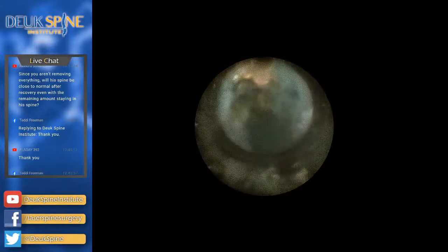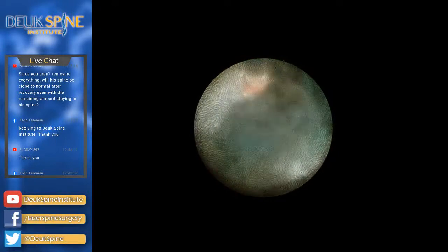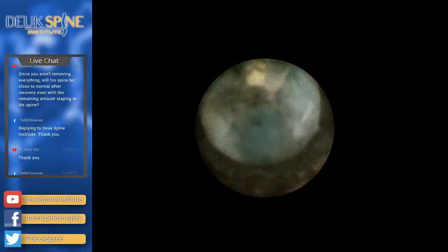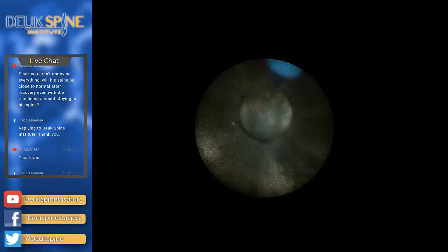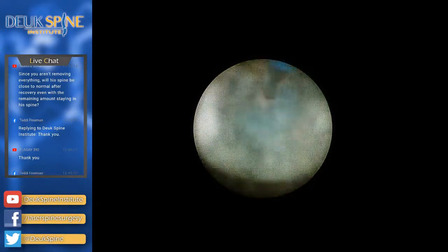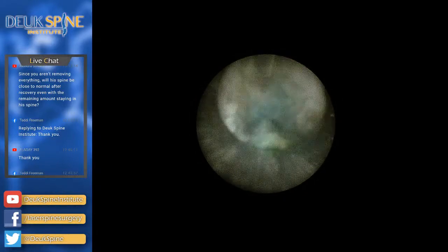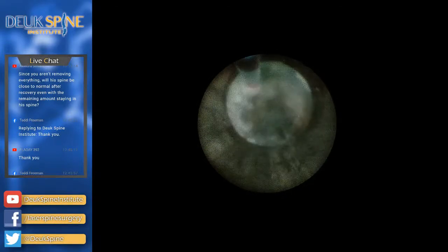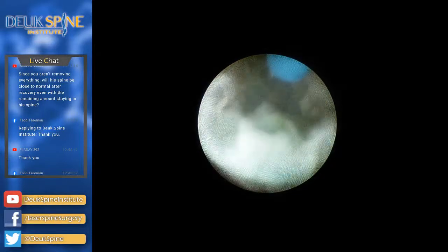Will that have an effect on the function or performance of the disc? The answer is most likely no. But this surgery you're watching now gives the disc the best chance of being normal, because the only other surgeries that are done are fusions for this kind of problem. And a fusion takes away the movement of the disc 100%. Your disc is totally abnormal after a fusion, which is the alternative surgery. Plus, of course, your bones and joints in your spine are all abnormal too, because you removed all of them, the ligaments and bones and joints, in order to do the fusion. So there's nothing normal about a fusion alternative, but there is the potential for being normal after the laser. I don't know if that answers the question, but that's the best I can do for you.